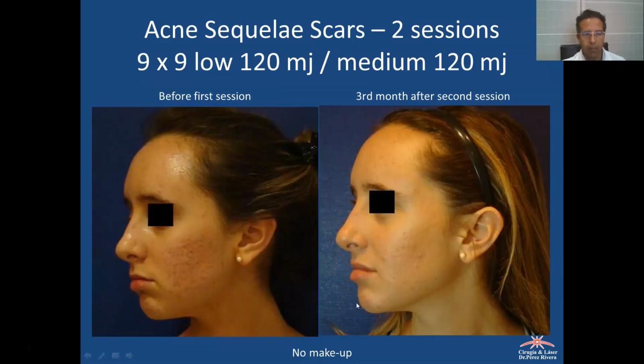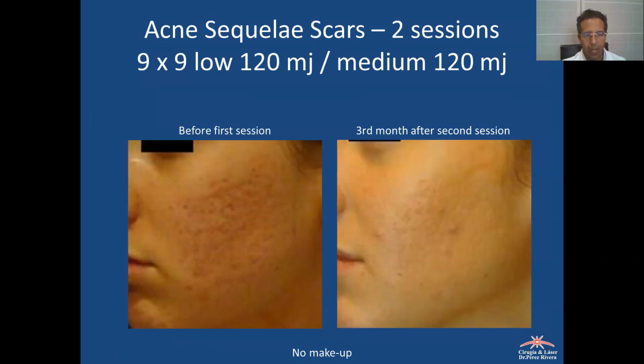Another profile, again I choose a small part of the face of my patient, a closer view, and again I take out the color of the photo, and you can better measure the reduction of dots, the reduction of scars in the skin of my patient.